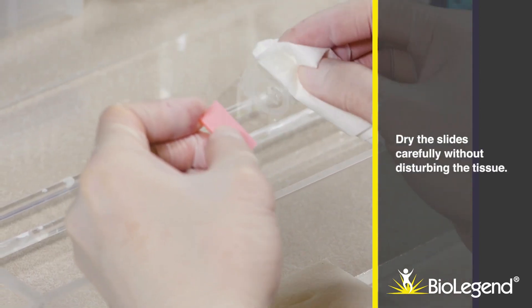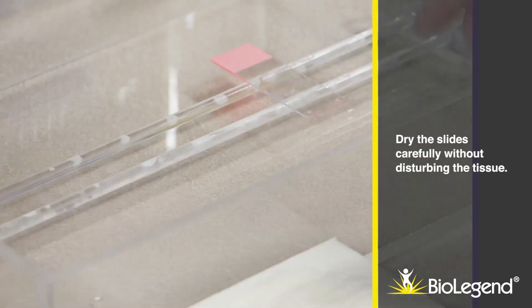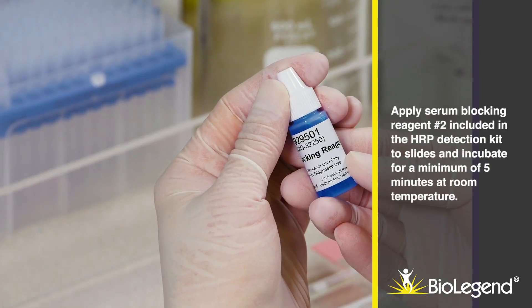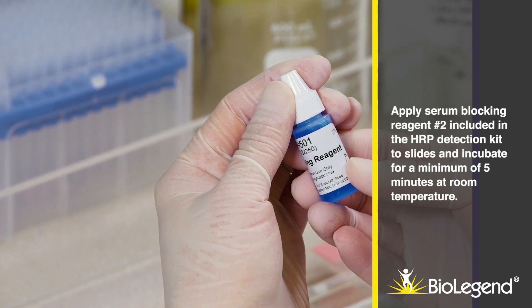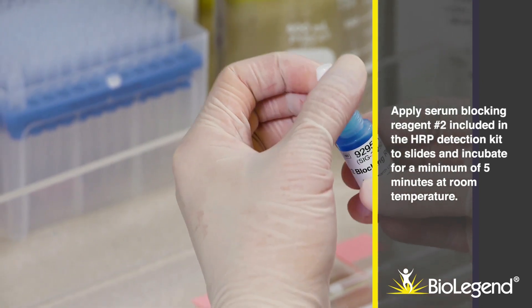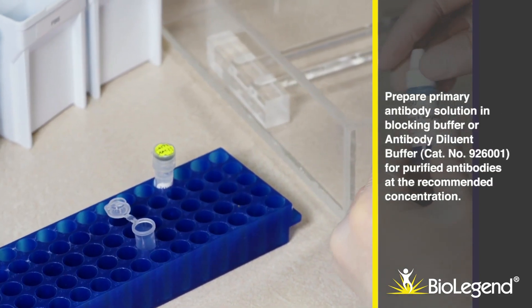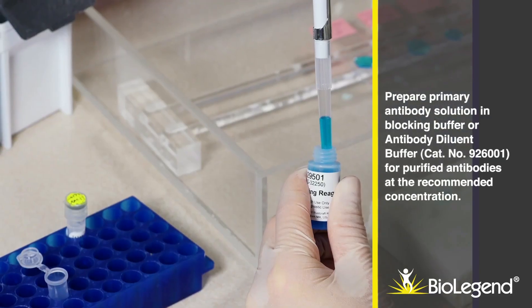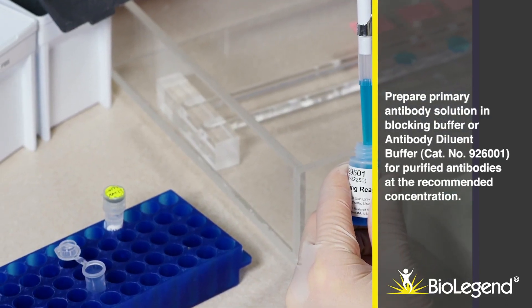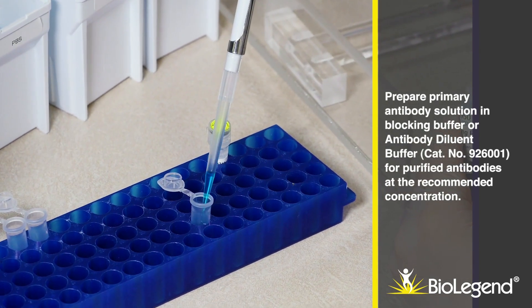Dry the slides carefully without disturbing the tissue. Apply serum blocking reagent number two, included in the HRP detection kit, to slides and incubate for a minimum of five minutes at room temperature. Prepare primary antibody solution in blocking buffer or antibody diluent buffer, catalog number 926001, for purified antibodies at the recommended concentration.